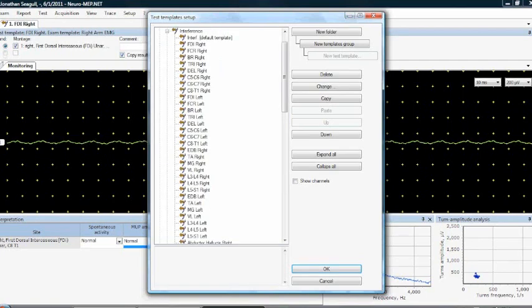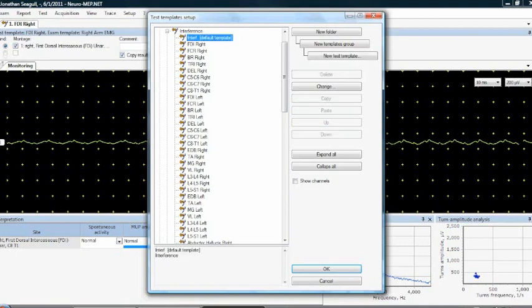Now here I advise you to mostly work with the default template because that's the thing that everything else is generated from. Obviously the things here we already pre-set up, so if you're happy with them, leave them. If you don't like them, you can change them. But if everything is working, just leave it alone. Just play with the test template, essentially. The default template, that is.